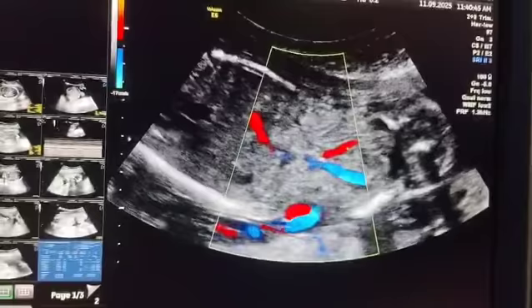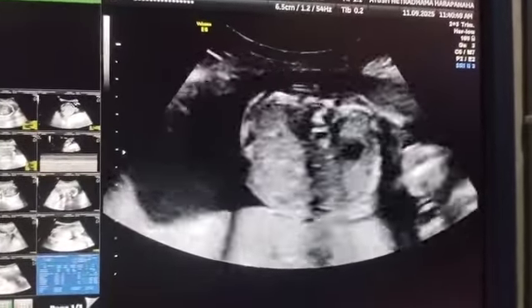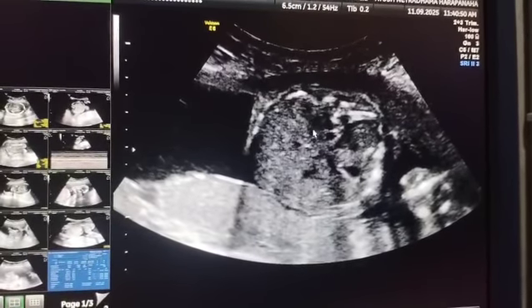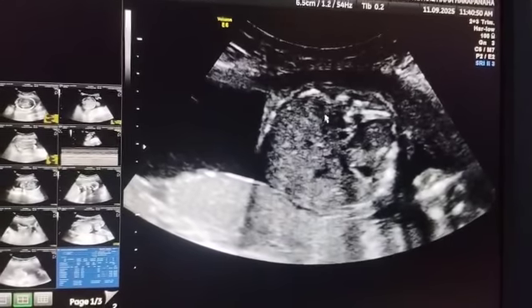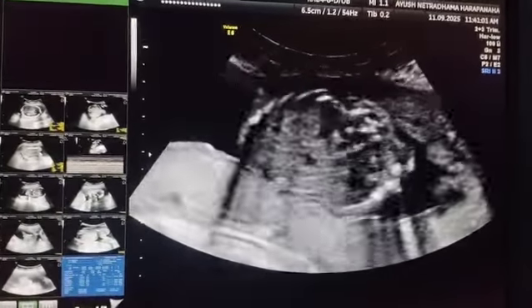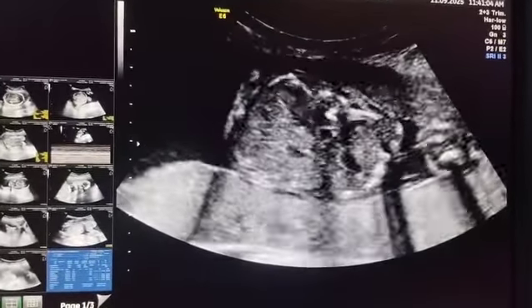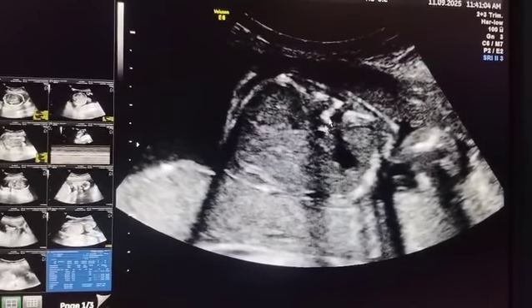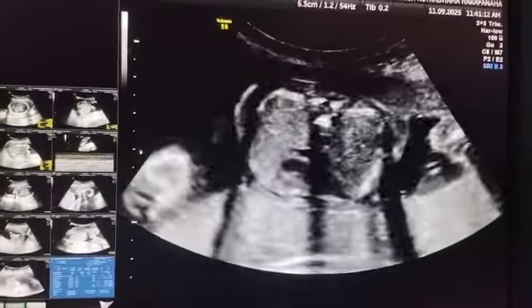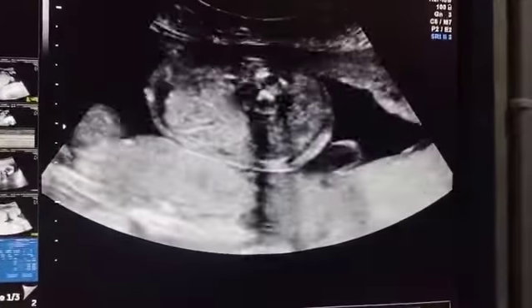And one sign that is important is the flat adrenal sign. Here you can make out this hypoechoic line is the adrenal gland. Adjacent to this we should see the renal echoes. So we don't see any renal echoes here. When we trace this, this is called a flat adrenal sign. Whereas here the adrenal is not as flat as this. So this is a flat adrenal sign. This indicates a unilateral kidney or a cross-fused ectopic kidney.